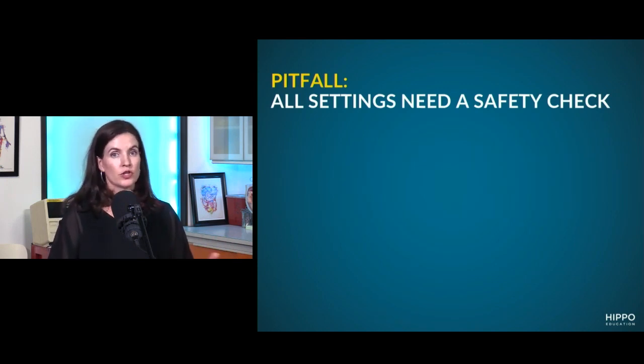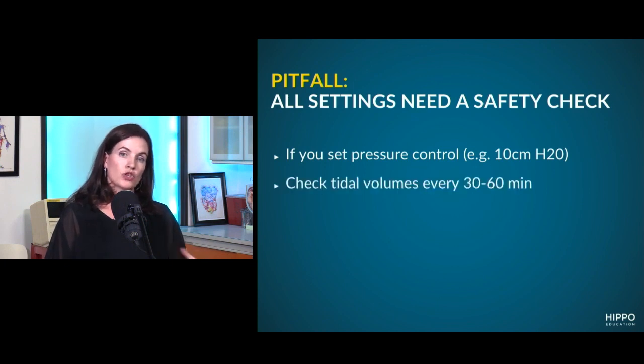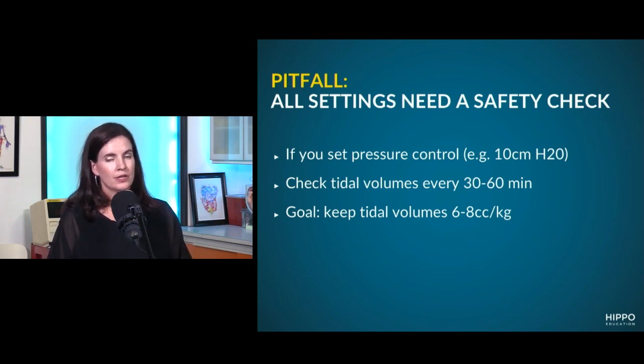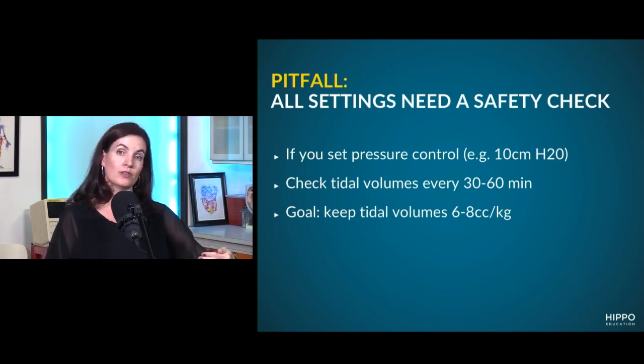So the converse situation is if you've set a pressure control instead, because maybe you work at a pressure control center, and that's fine. So if you want to start setting a pressure control, I usually start with 10 centimeters of water as your initial driving pressure. And then I want to check to make sure that the volumes are acceptable. So I would have a look at the tidal volume and make sure I'm keeping them between 6 to 8 cc's per kilo. So no matter what you set, you need to have calculated your patient's ideal tidal volume, because you either are going to set that up front or you're going to use that in your safety check.